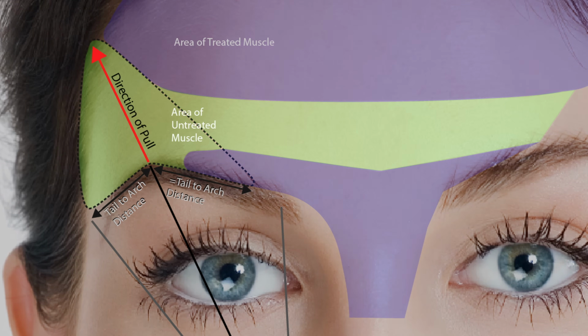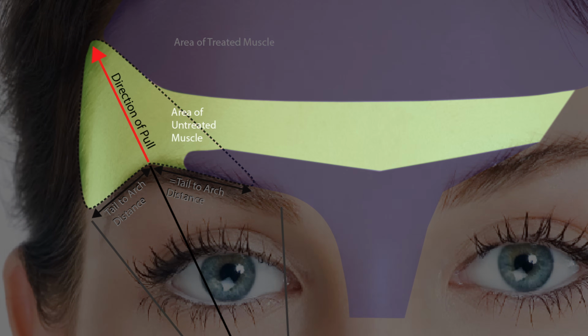Of course, there are also other areas of the frontalis muscle that we do not want to treat, and before we start treatment planning, it's important to rule those areas out too. To prevent a medial brow ptosis, it's a good idea to leave a good portion of the frontalis muscle active in the lower third. Typically, I use a rule of 2 centimeters from the orbital ridge, and I'll draw a line here, beneath which is an area I consider to be a safety zone where I should avoid.